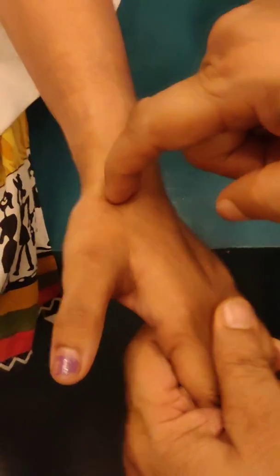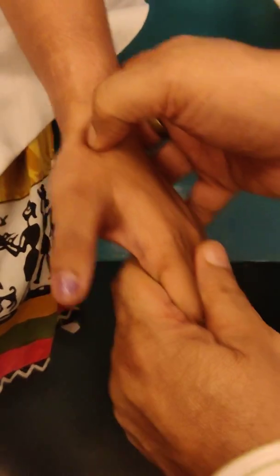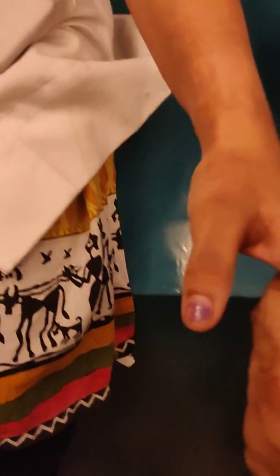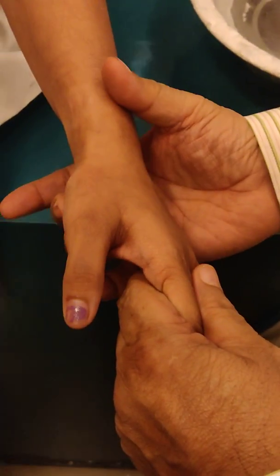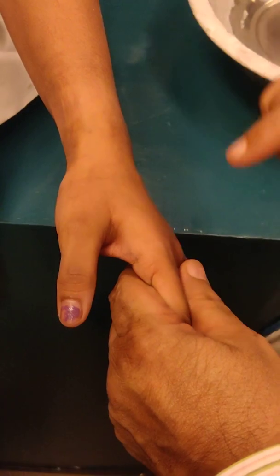So this snuff box is tender in scaphoid fractures. Fall on an outstretched hand and tenderness here.